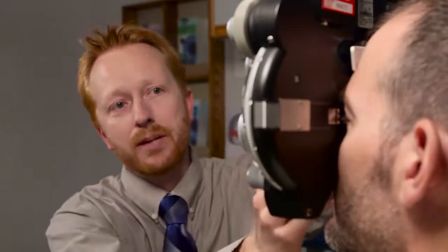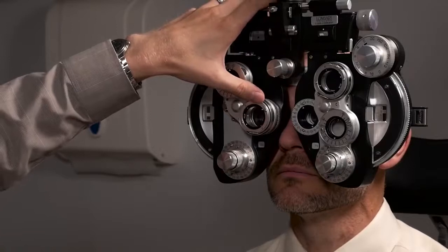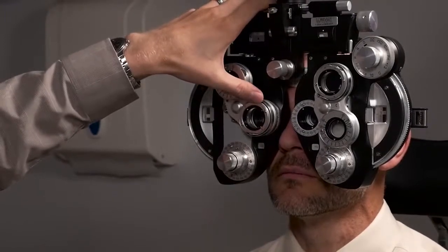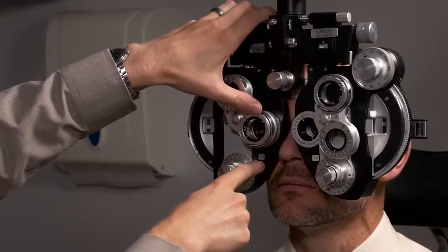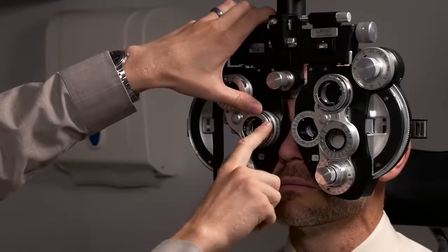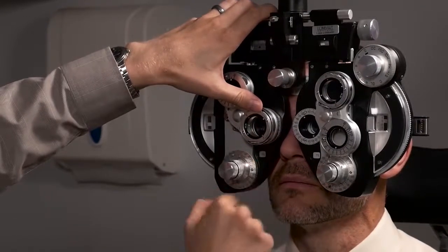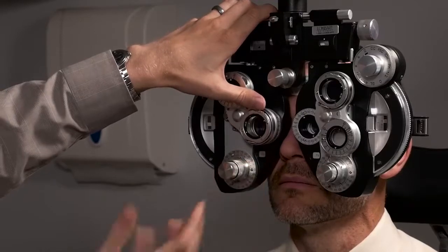As I flip the JCC, I ask him what looks more sharp and clear. I ask, 'What is more sharp and clear, number one or number two?' — Number one. For a plus cylinder phoropter, which this is, we turn the dial in the direction of the white dot on the JCC. Because he said number one is better, and it's currently at about 85 degrees, I turn it to about 75 degrees.